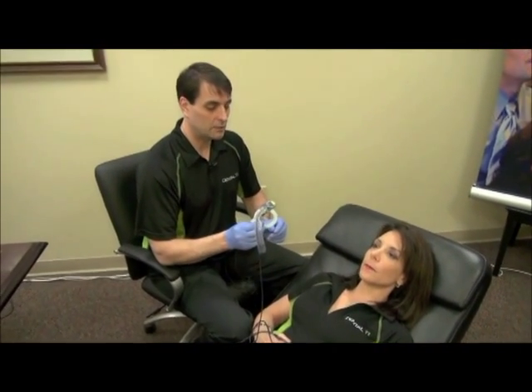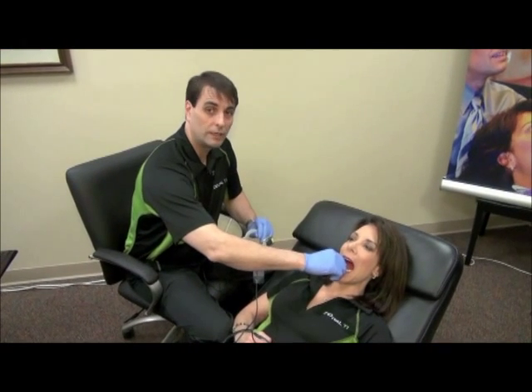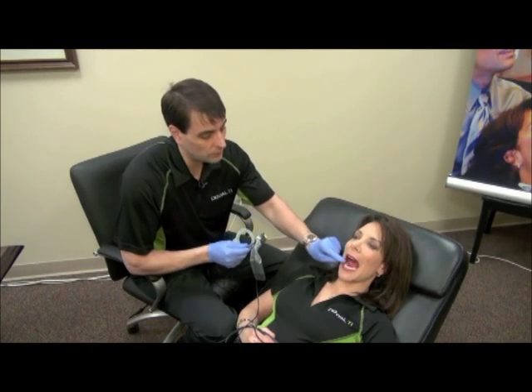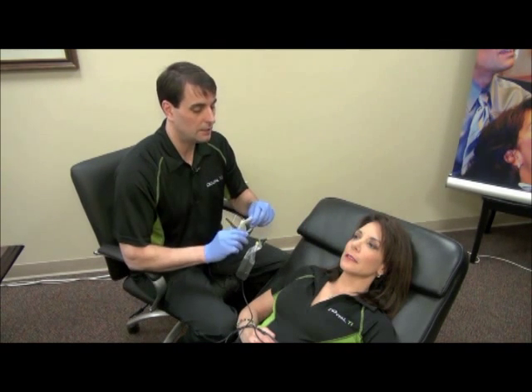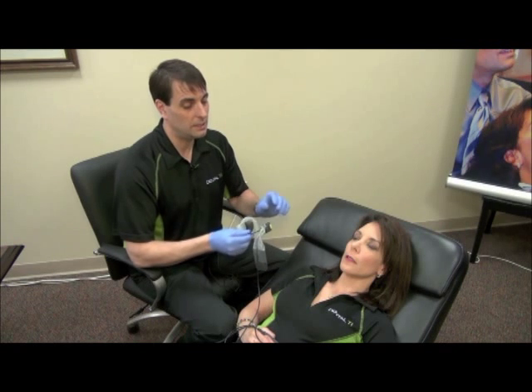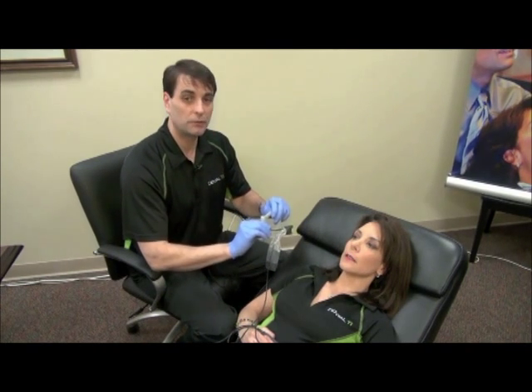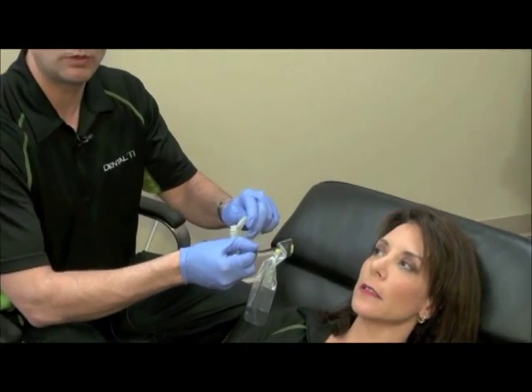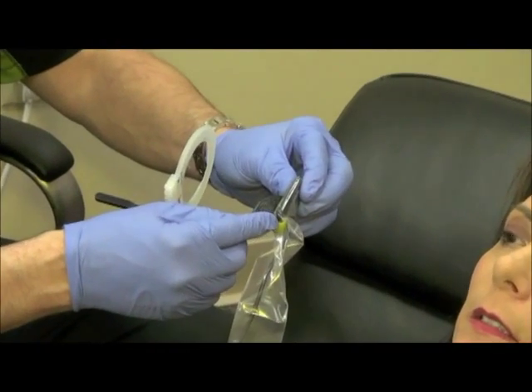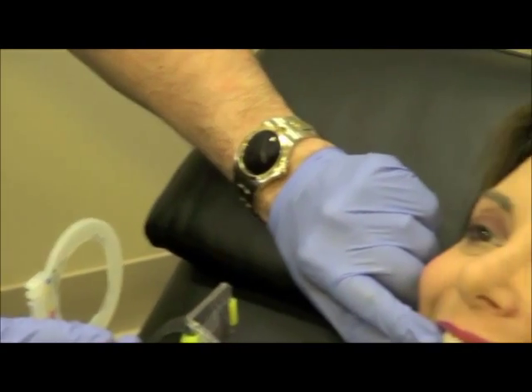The key in taking this x-ray and making it comfortable is to make sure that as you're placing it, you're paying attention to the bony ridge behind the lower anterior teeth — you want to avoid pushing or jabbing the sensor into that region. I always say to visualize where you want the sensor to go ahead of time and then go there very deliberately and quickly so you're not moving the sensor in the mouth and initiating the gag reflex. For the premolar bite wing, you simply shift the sensor — it's a much more extreme shift than you might imagine. Every sensor has a little bit of an inactive area around the perimeter, so you can't just pull it forward. These lines will be bisecting the premolar to canine contact.